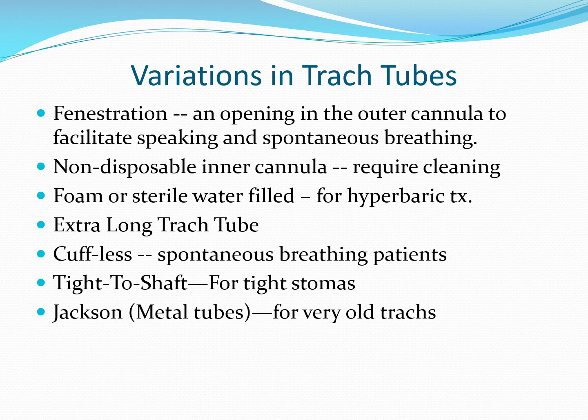And then you have the old Jackson metal tubes. The Jackson metal tubes, they were at one time made of silver. Just for a whole lot of reasons, scarcity of silver, the cost of silver, things along those lines, they switched over to stainless steel, surgical grade stainless steel. But just bear in mind that folks that had Jackson tubes that were silver, silver is bacteriostatic. So that silver wasn't used for bragging rights or anything along those lines. It was used for a very practical reason: silver will tend to discourage microbial growth. You won't see many of those, but they're out there.